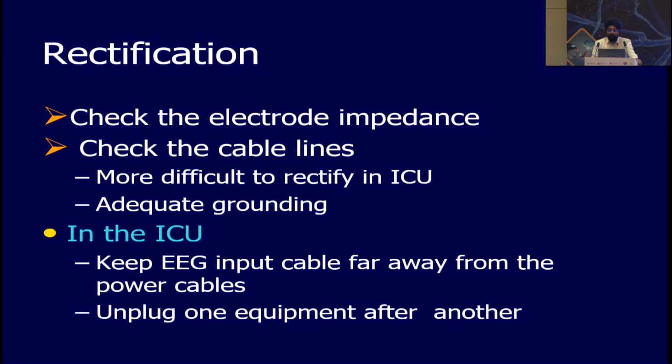Rectification: check the electrode impedance, check the cable line. It is more difficult to rectify in ICU because a lot of other things are going on. But grounding should be adequate. That is very, very important. In the ICU, keep EEG input cable far from the power cables. And sometimes the technician has to do a lot of work because artifact is coming in the EEG and you have to unplug one equipment after another to find out where is the fault.